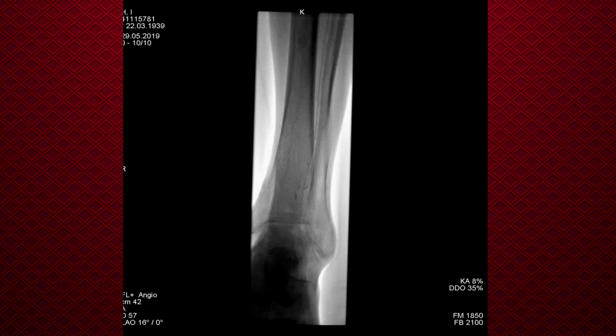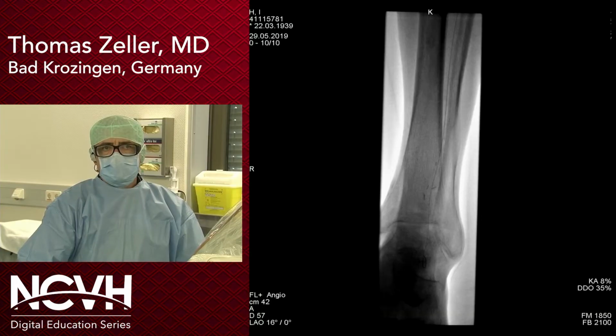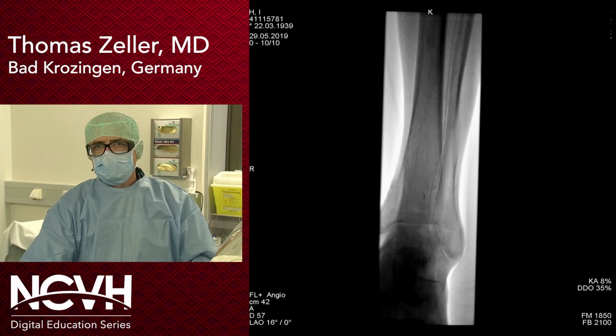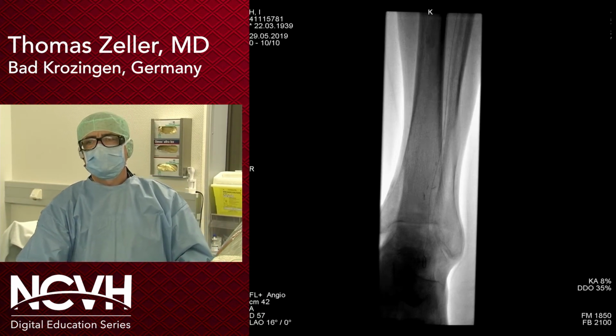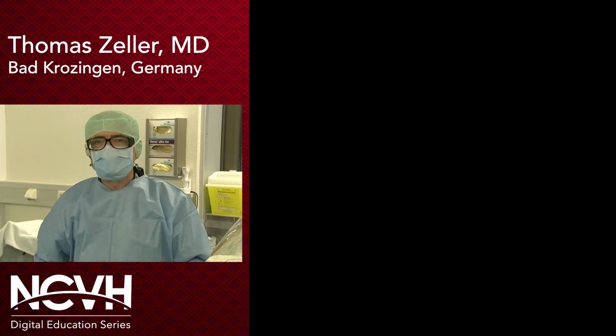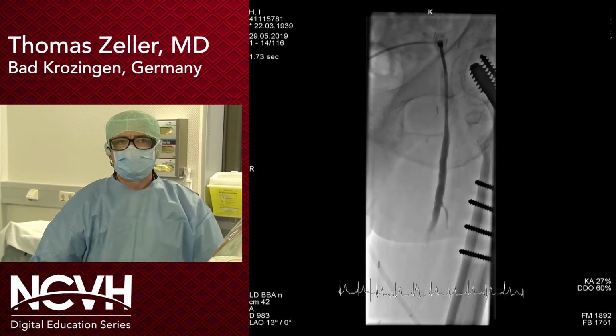Now we can go live, but are there any comments from the podium so far with regard to this case presentation? This is a very complex case. I think we'll be very interested to see what your approach is. Okay. Well, then let's go live to the screen here.